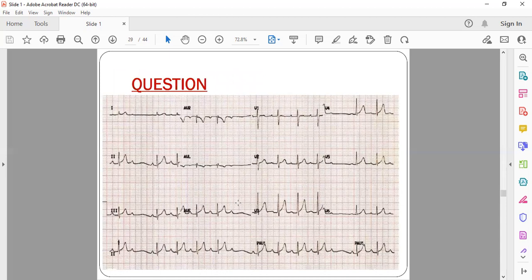You can see this ECG. It may not look like a bradycardia, but definitely you can see here one P, the PR interval here, and the PR interval is getting prolonged, again prolonged and prolonged, and again a P wave has suddenly dropped here. There is no QRS after this P wave. So this goes in favor of Mobitz type 1 block.